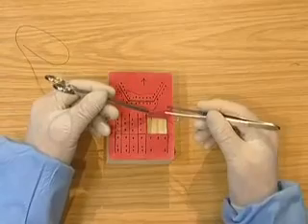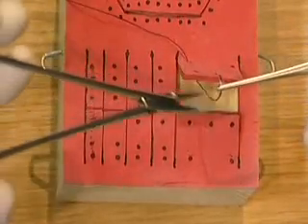Lift up the flap, go in at right angles, and pick up the needle with the tissue pickups. Change to the reverse grip, then pen grip, picking up the needle with the tissue pickups. Unlock the needle using reverse grip and pull the thread through.